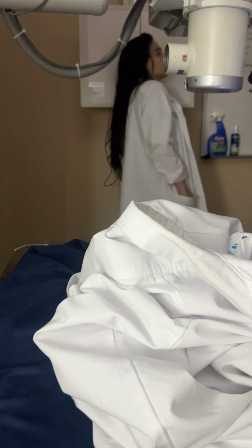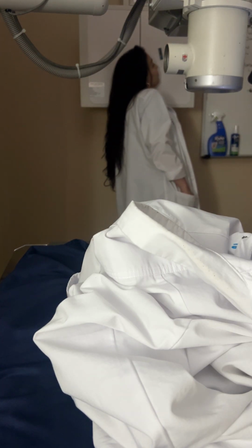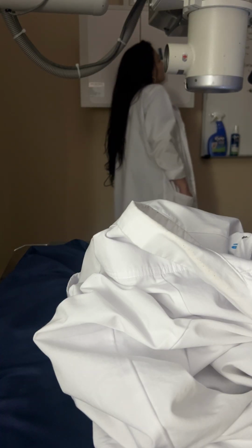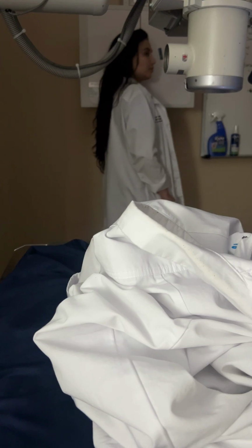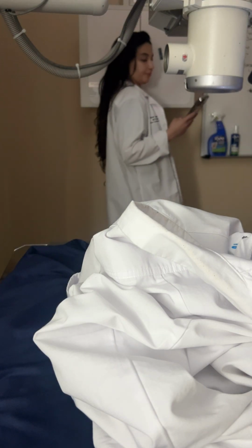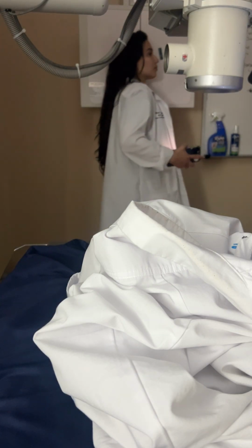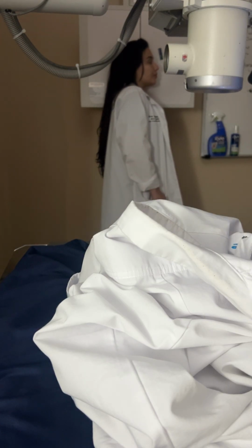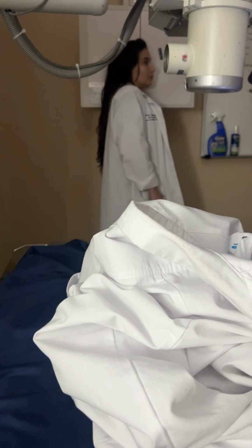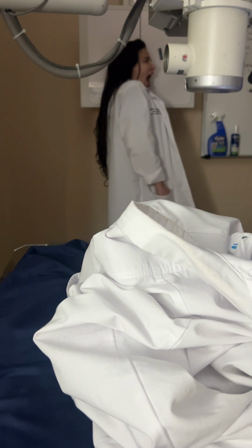Okay, so for your notes, the area of interest is going to be parallel to the IR as follows. For the mandibular ramus, you're going to have the patient in a true lateral, so no rotation toward the bucky, okay? For the body, you're going to rotate the head 30 degrees toward the IR.